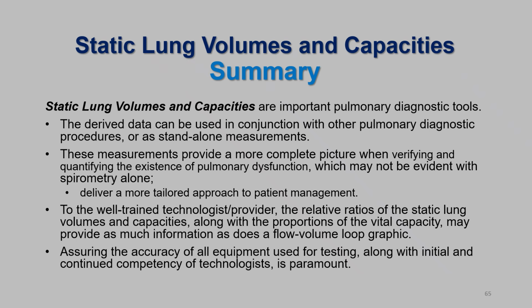The technologist, as well as the physician interpreting the final results, must be cognizant of the limitations associated with each procedure employed in the testing process, and be able to verify if the derived data are compatible with the patient's clinical presentation.